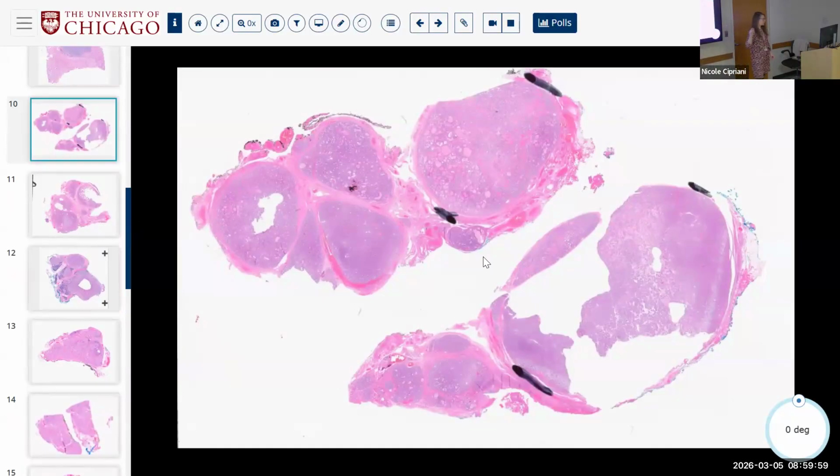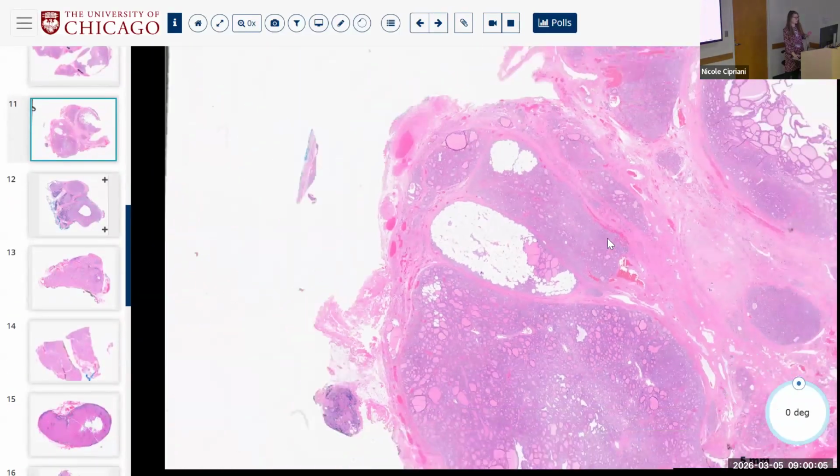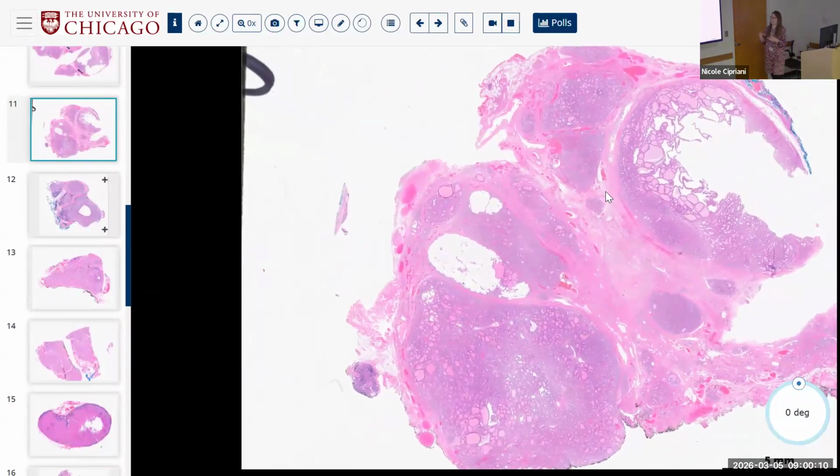Think about PTEN. The other thing that the PTEN tumors sometimes have is lipomatous stromal change. Sometimes they have what's been described as a nodule in nodule appearance, where there are areas of hypercellularity within a larger lower cellularity nodule. On the FNA molecular, there was a PTEN mutation in the nodule. There was also a RAS mutation, but this could be a RAS mutation developing on top of germline PTEN.